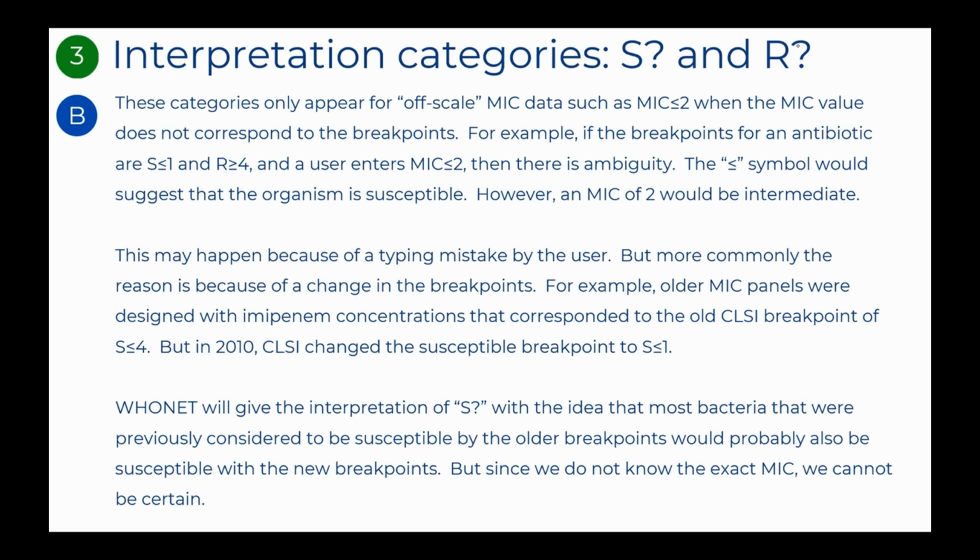For example, older MIC panels were designed with imipenem concentrations that corresponded to the old CLSI breakpoint of S ≤4. But in 2010, CLSI changed the susceptible breakpoint to S ≤1, which led to difficulty in interpreting results from the older test panels. In this situation, WHONET will give the interpretation of S? with the idea that most bacteria that were previously considered to be susceptible by the older breakpoints would probably also be susceptible with the new breakpoints. But since we do not know the exact MIC, we cannot be certain.